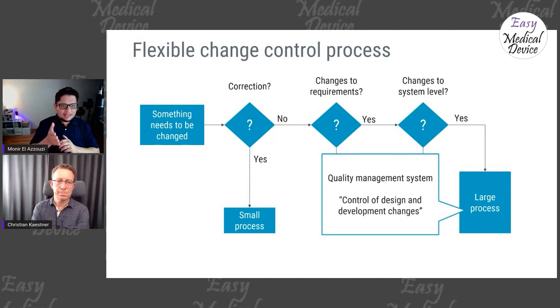So this system, as presented by Christian, should also integrate this kind of thing, to say, oh, is this change considered as significant? Maybe then we can make it a large process change or whatever. But you also have to have that inside your system, to say, okay, we are making this change. Let's put it inside the filter of significant change per EU MDR. If yes, then be careful, because then you can be following the MDR when you should not, maybe.